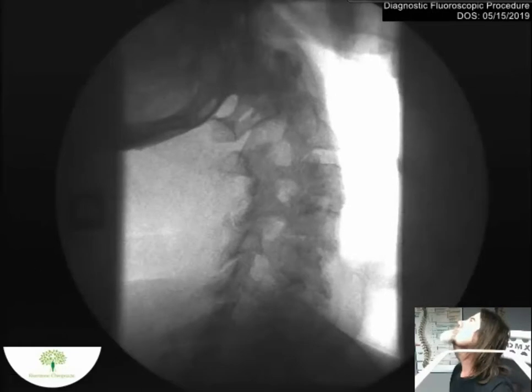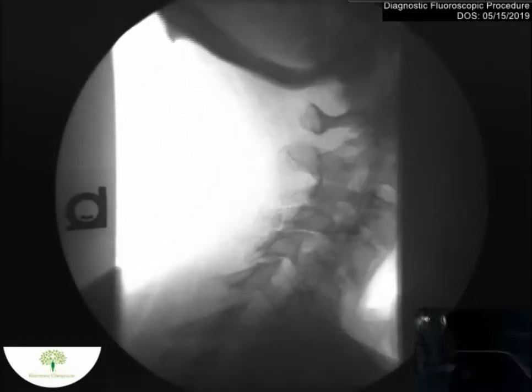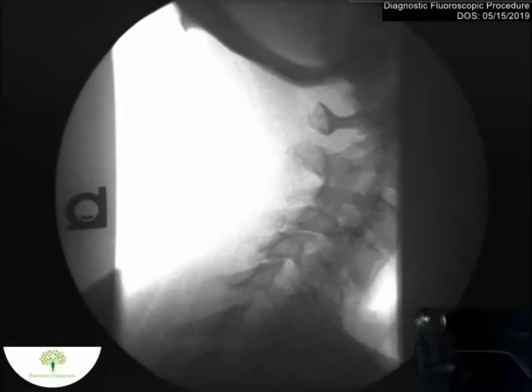That's the unique thing about digital motion x-ray, is that we have a specific protocol for each part of the body, put stress on different ligaments, and also get different angles so we can see if there is an injury. This is very good for car accidents, motorcycle accidents, sports injuries, or if you're having neck pain, back pain, extremity pain, and you've done all different kinds of tests and you're looking for the next step, you might be a candidate for DMX.